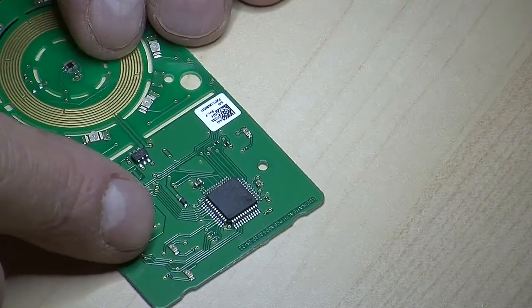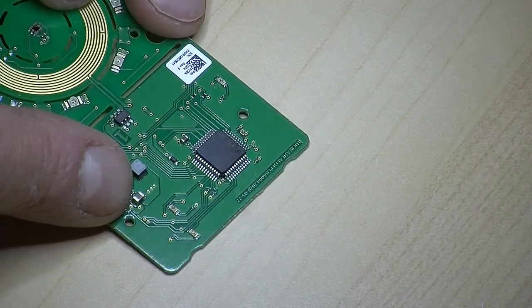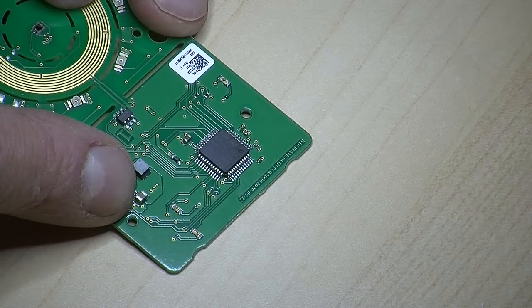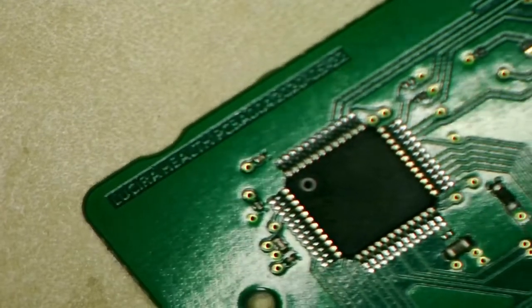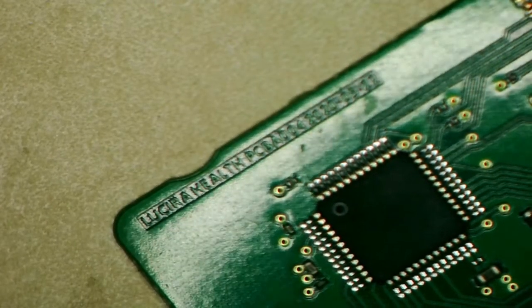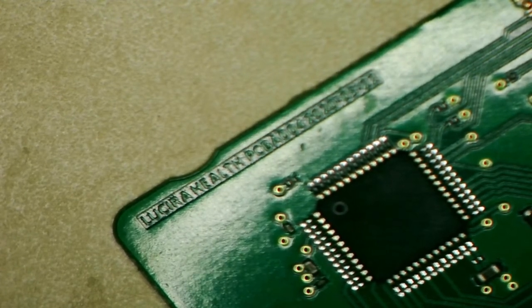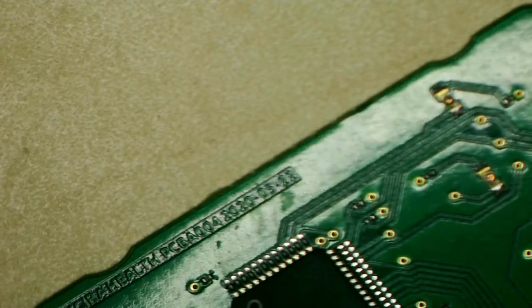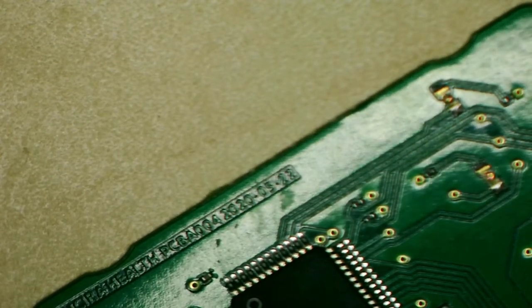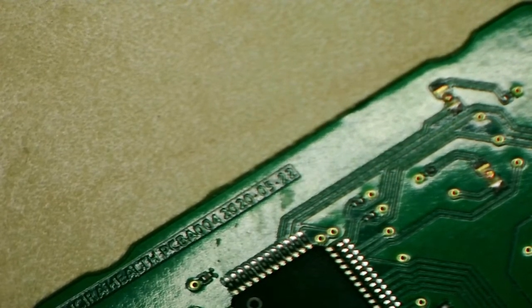The other thing is, as you would expect with a medical device, not too clear, but there is a date code. Let me just turn it the other way so we can read it a bit better. Lucira is the company that makes the test, and then there is what looks like a date code, 2020-05-22. So this thing was made in May of 2020.